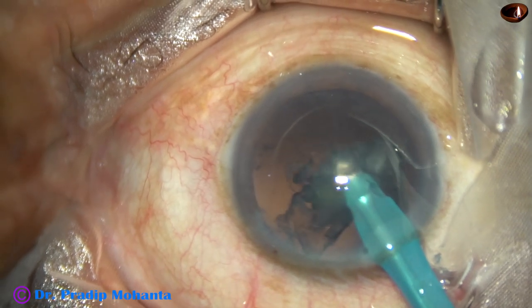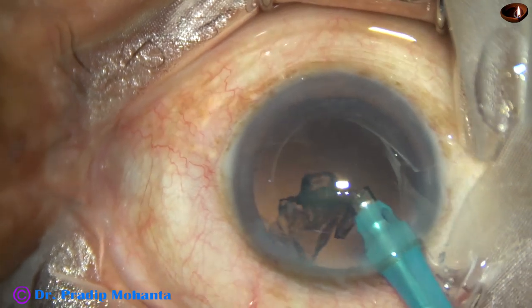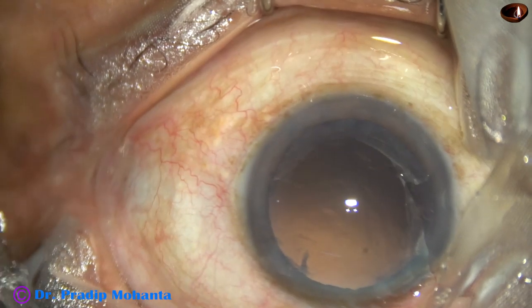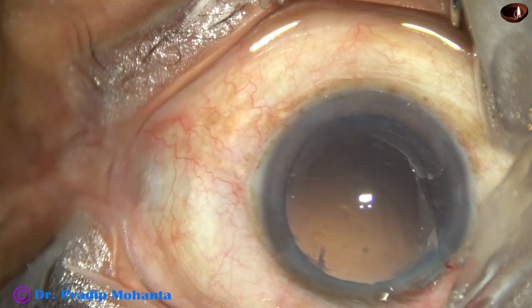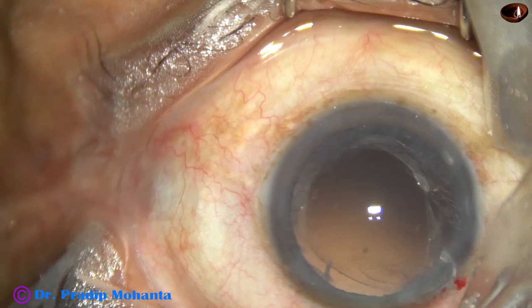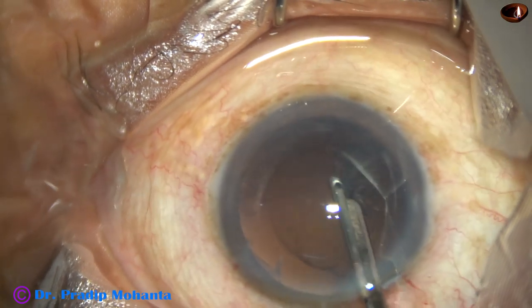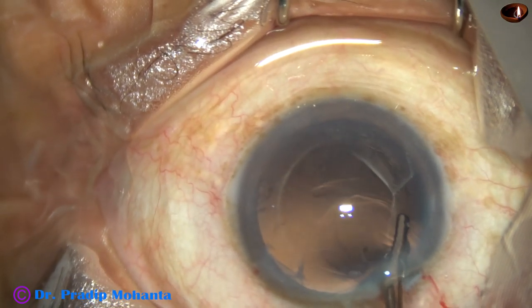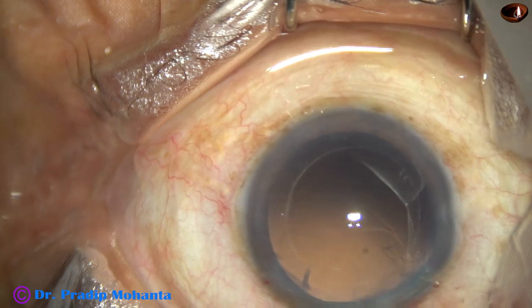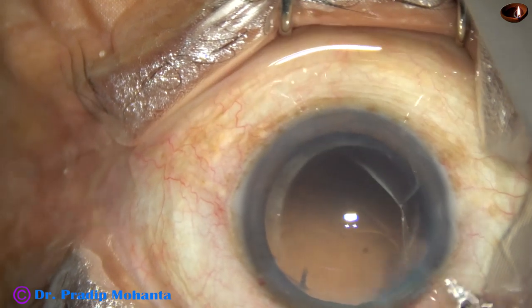So, it is much better if we can do the surgery in a short time in a routine case. The nucleus is managed. The epinucleus has also come out, and there is very little cortex. Since there is only one side port, I am using a Simcoe cannula to remove the cortex. There is some cortex from 4 o'clock to 8 o'clock.